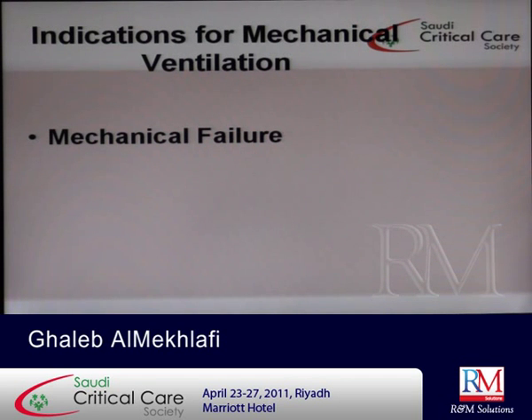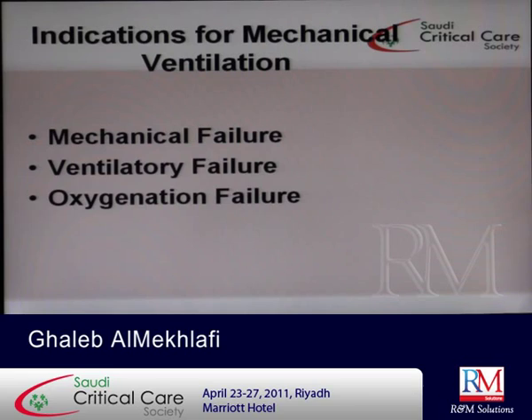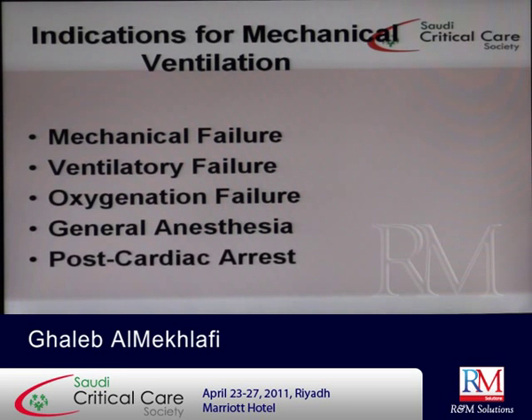If there is a mechanical failure or ventilatory failure, that is, there is accumulation of CO2 like in COPD, or oxygenation failure, that is, if there is pulmonary edema or ARDS, or general anesthesia before surgery because the patient will be paralyzed, or post-cardiac arrest if the patient is unconscious and there is no drive for respiration, whether it is due to drugs or whatever.